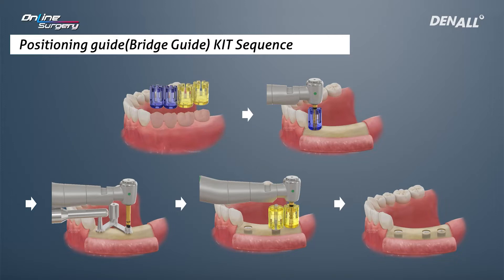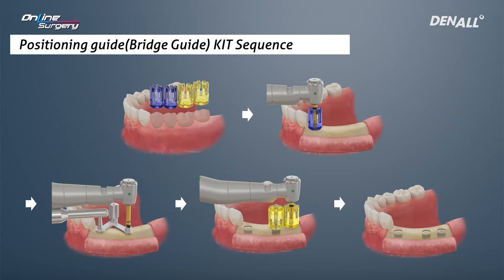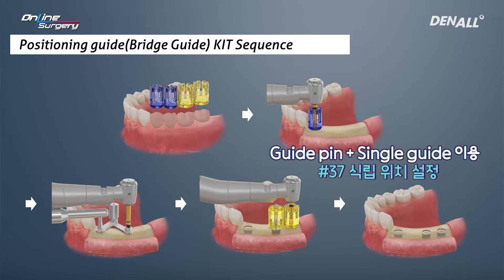In number five, an implant is not going to be placed, so number four is going to be done first. For number six, a bridging guide is going to be used to get position and placement is going to be done. After placing number six, superior to the fixture, a guide pin is going to be used and number seven is going to be placed — that is the sequence.